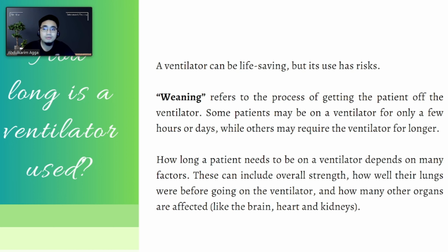Again, just like what I've said a while ago, your ventilators can be temporary or permanent by nature. So how long a patient needs to be on a ventilator depends on many factors. This can include the overall strength of the lungs, how well their lungs were before going on the ventilator, and how many other organs are affected, like the brain, heart, and kidneys.